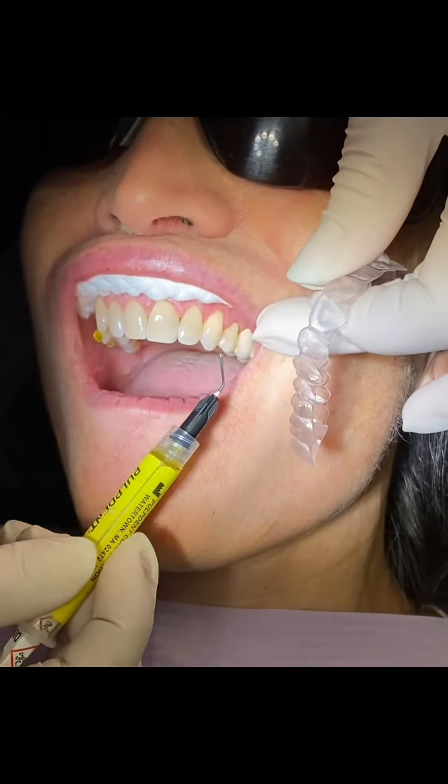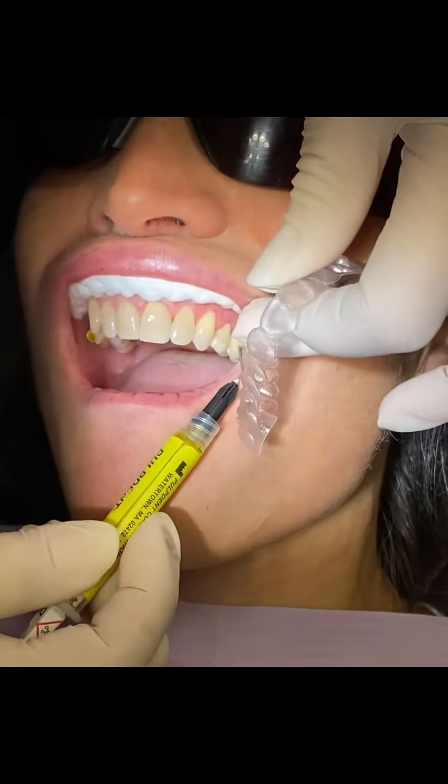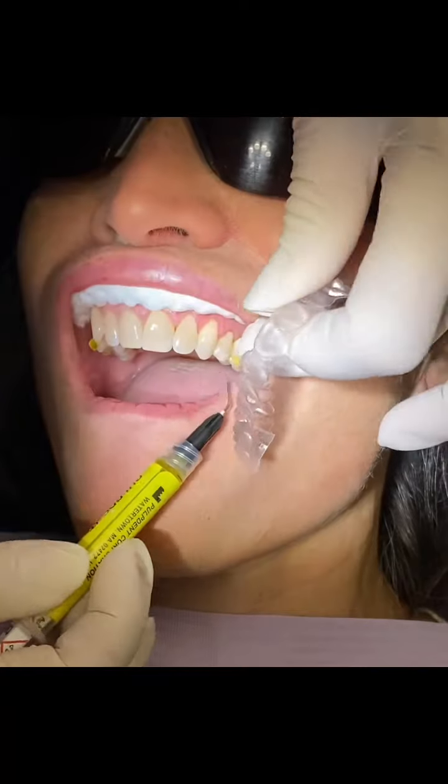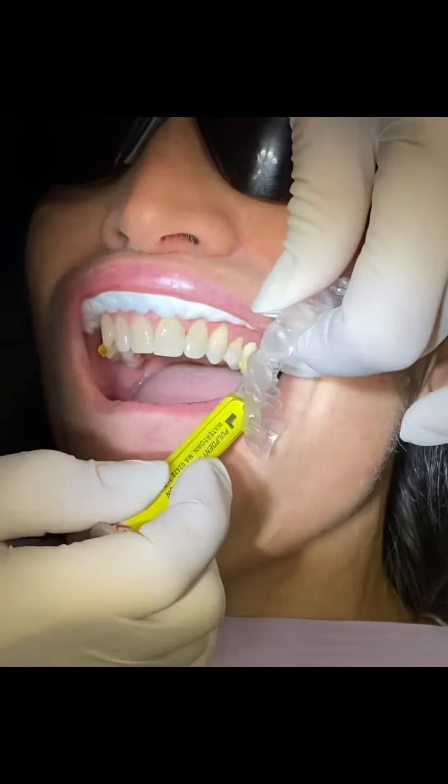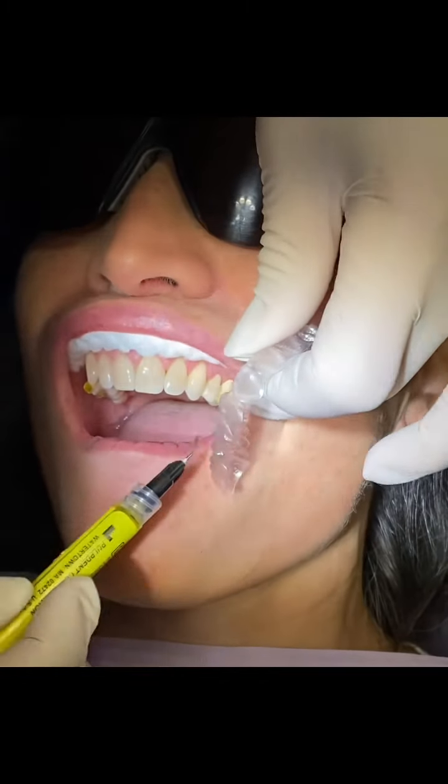We're extra careful with the fact we're using this in the mouth, but it really makes an important addition because it's at times difficult to keep the attachments on teeth with porcelain.